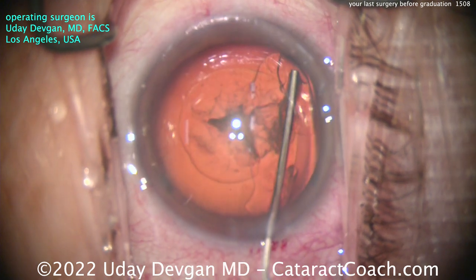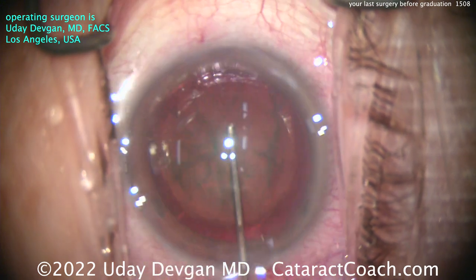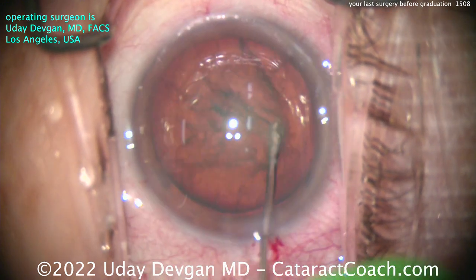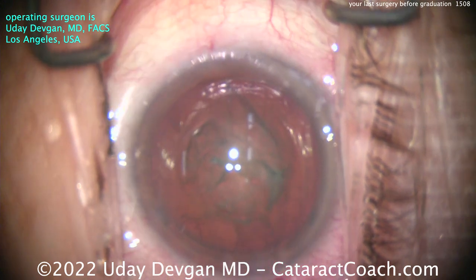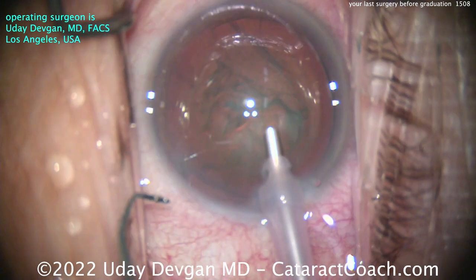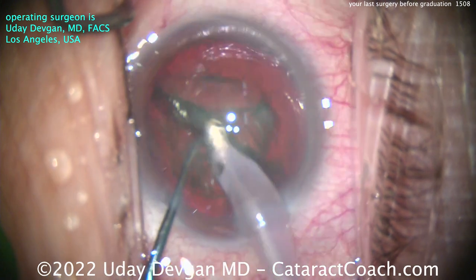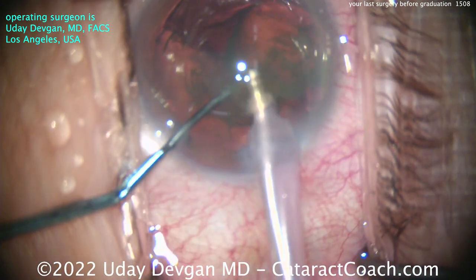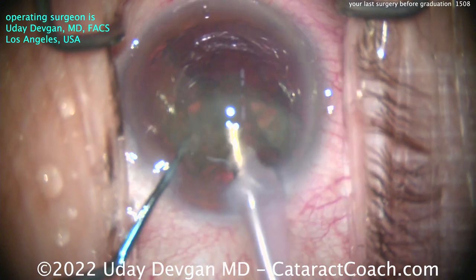Now, balanced salt solution on a blunt cannula for hydrodissection. The big differentiator in your practice is not knowledge — all ophthalmologists are smart. It's not even bedside manner, because all ophthalmologists want to help patients and be kind. The challenge and differentiator is surgical skill. There's a bell curve of surgical skill, and the question is: do you have the drive and determination to climb that bell curve? Look at that chop — cleanly done. One half of the nucleus is pulled out of the way, the second half brought up with vacuum and emulsified at the iris plane with minimal phaco energy and very stable fluidics.